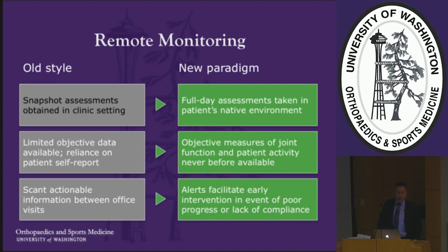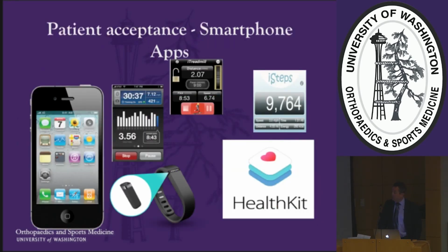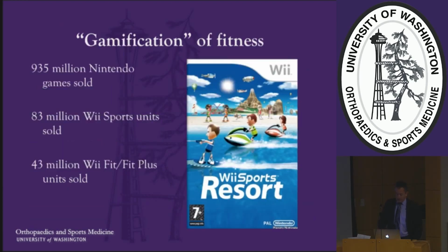So what remote monitoring does is it allows full-day assessments in the patient's native environment. We can look at the patients in the wild. We don't have to bring them into the zoo and watch them in the clinic. And it allows us to do real-time objective measurement. One of the questions that we always have is, will patients accept this? And the answer is that patients, in fact, are very comfortable with remote monitoring, and in many ways, they're way ahead of us. And this goes along with the popularity of electronic fitness products.